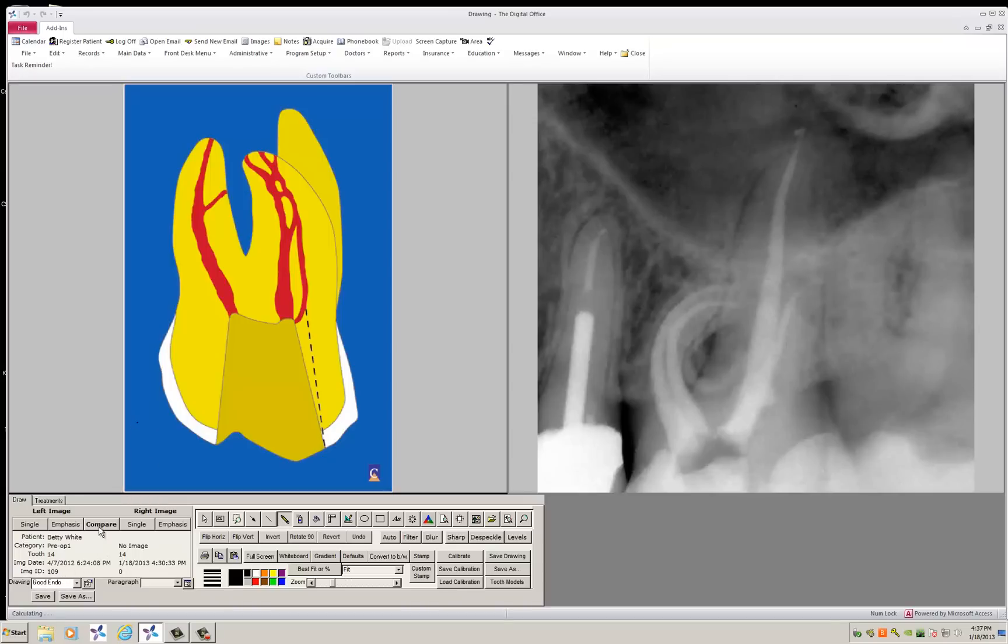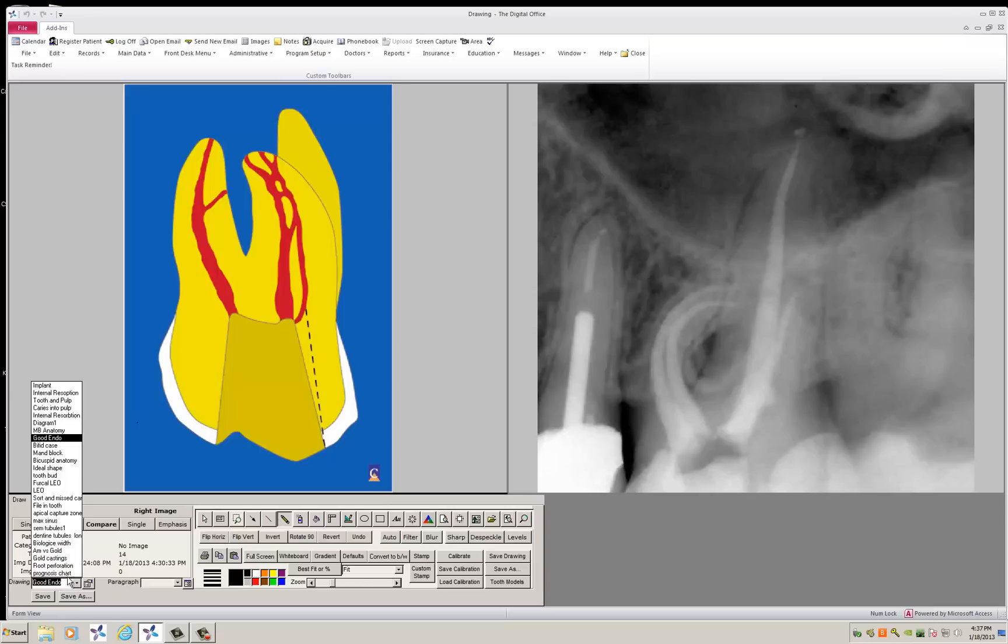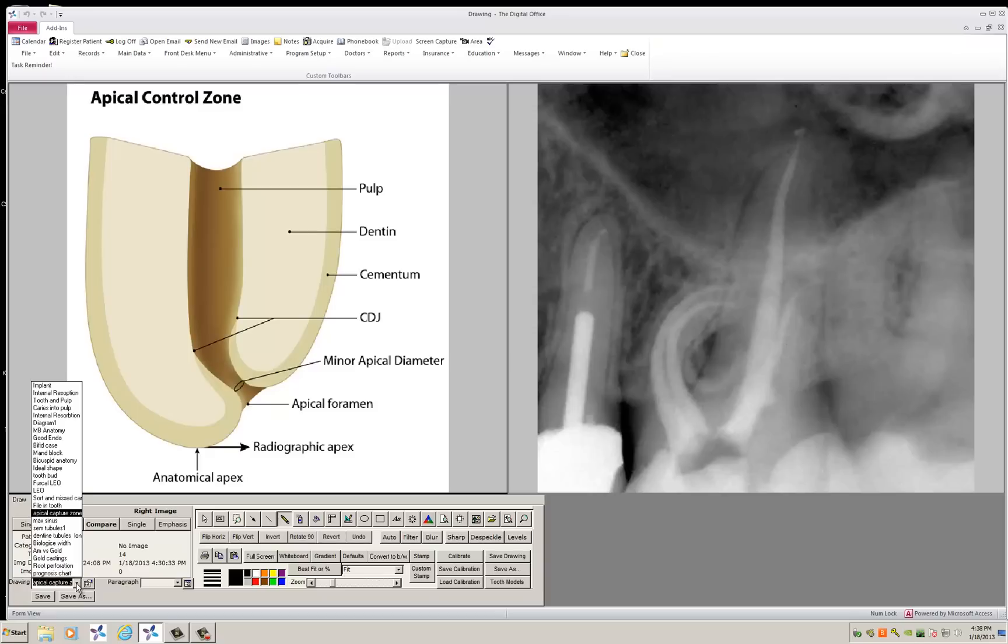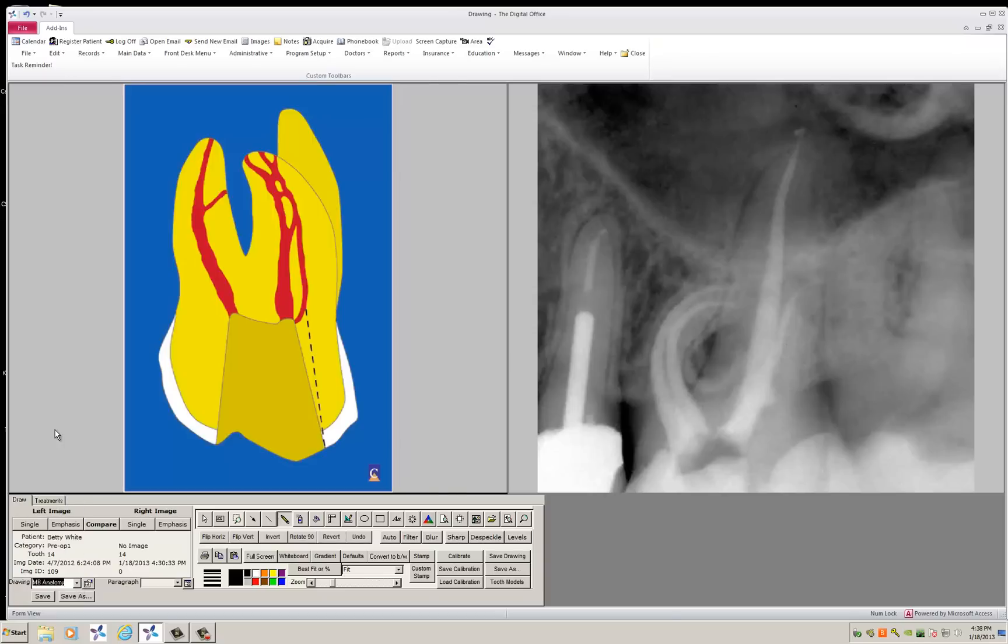So it's worthwhile spending some time getting comfortable with these. Every time you click on a box and come to your predefined drawing, you can load the diagrams that you have. You can add to your library here very simply. For example, let's say we're doing a case and we want to add another case to show the mesial buccal root.